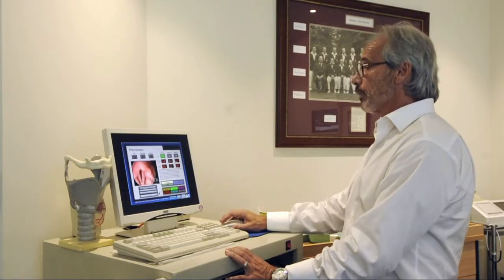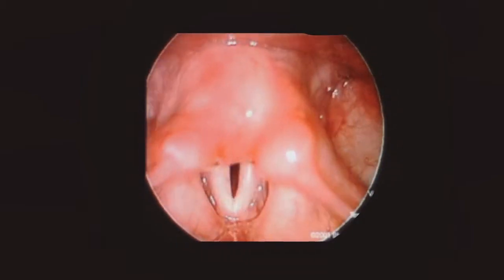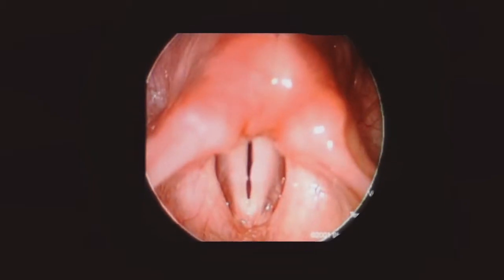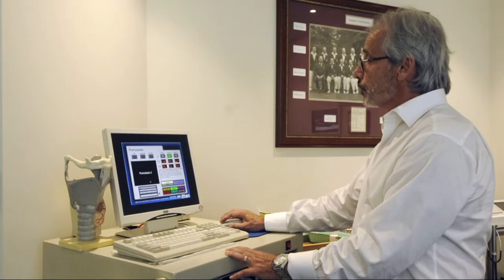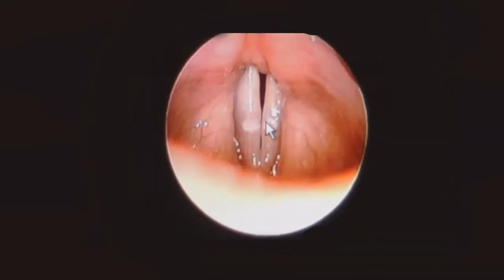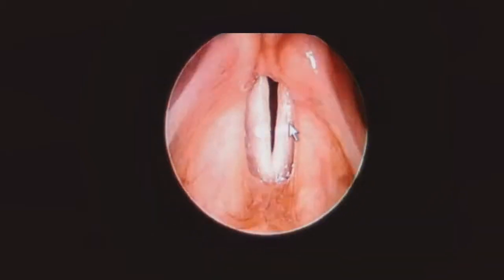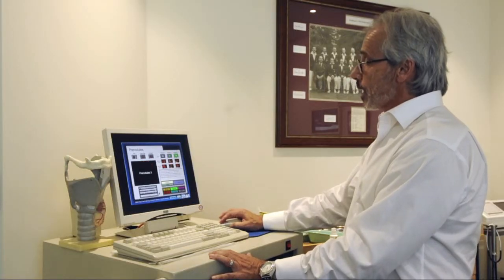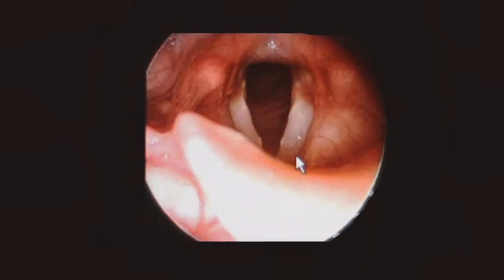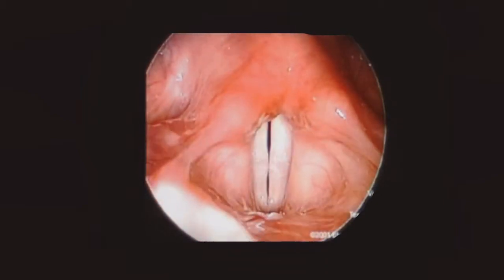Pre-nodular thickening of the larynx is probably the most common benign pathology and is due to inappropriate or overuse of the voice. Focus here and you'll see little thickenings at the free edge of the cords. In patient two, you can see these two little white dots where they're almost like precalluses starting to form on the vocal folds. Pre-nodular thickenings are entirely benign, do not require surgical intervention, and respond very well to speech therapy.